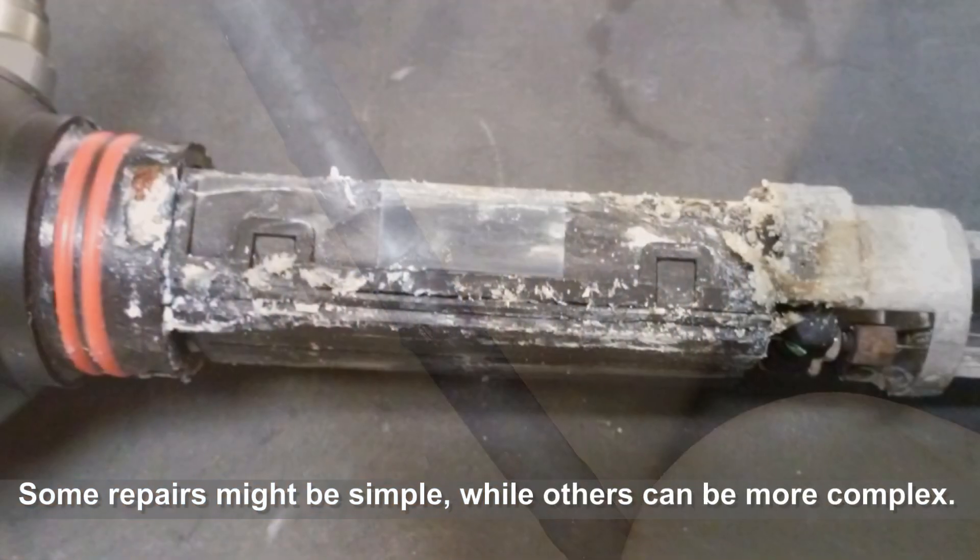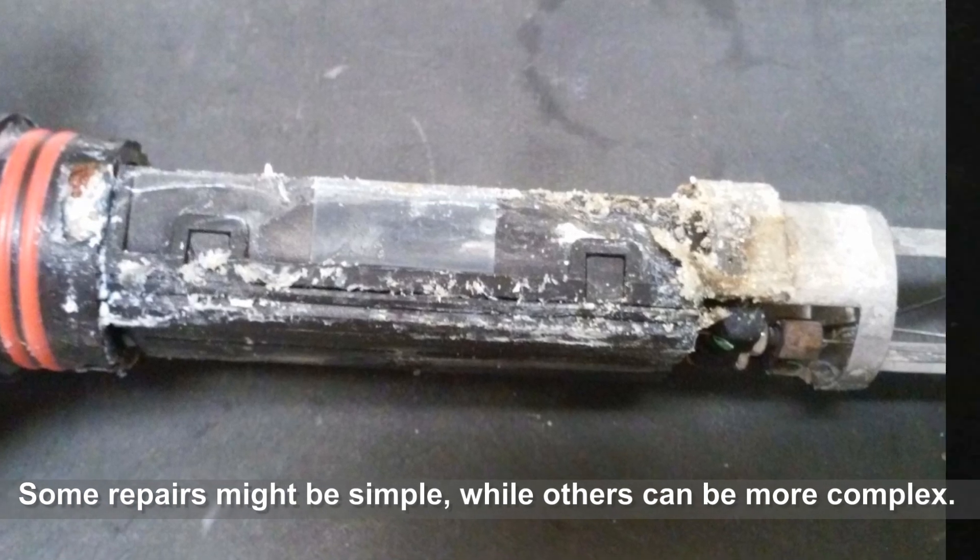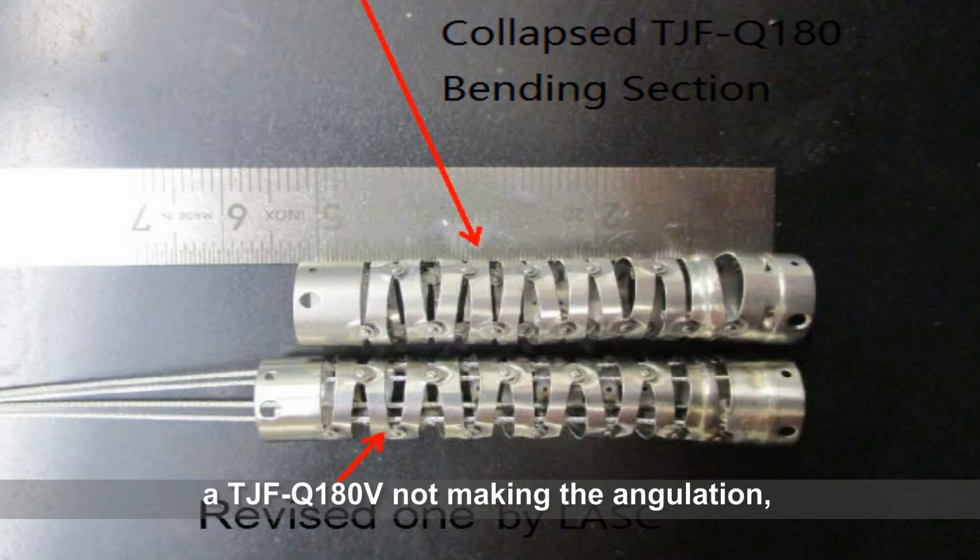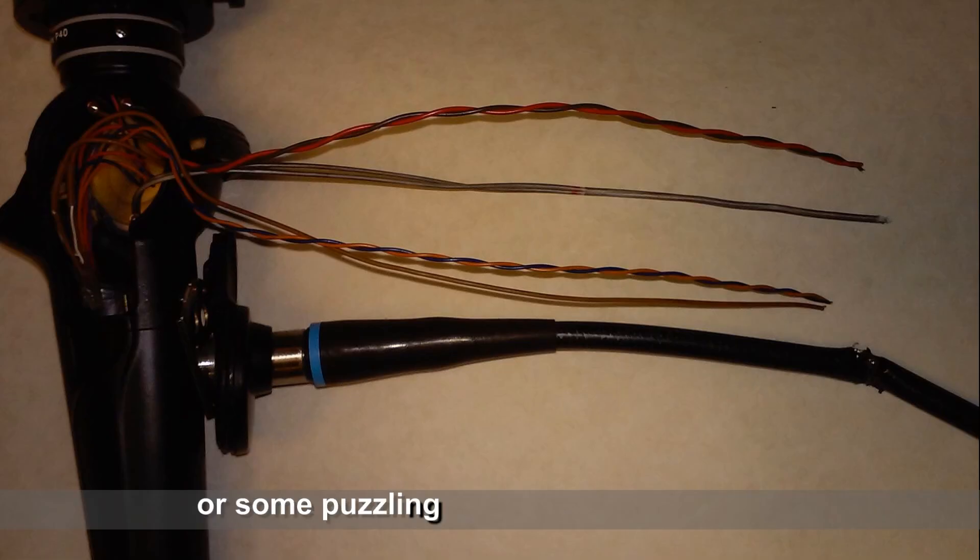Some repairs might be simple while others can be more complex. You might have a duodenoscope, TJF-Q180V not making the angulation, or some puzzling insertion tube problem like blistering, buckling, or discoloration.